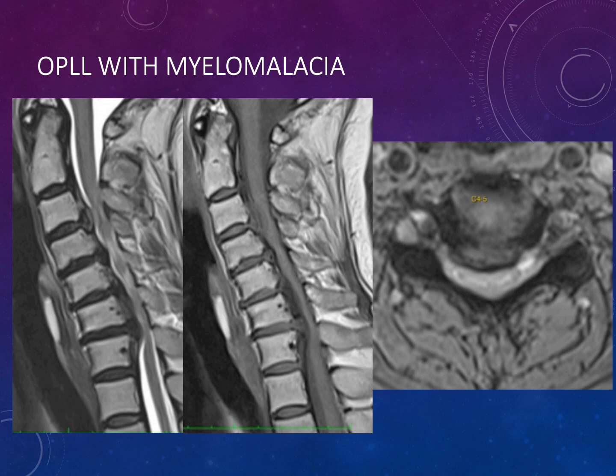There are other sources of canal narrowing beyond disc pathology. Ossification of the posterior longitudinal ligament (OPLL) can cause massive narrowing of the canal. On gradient echo images, OPLL can show high signal because marrow signal extends into it.